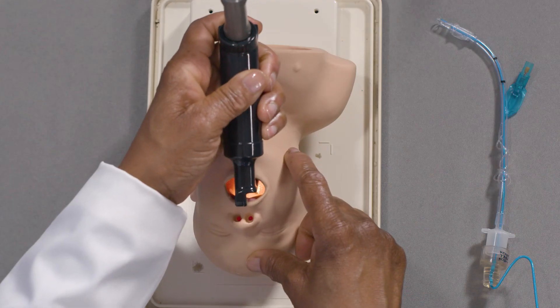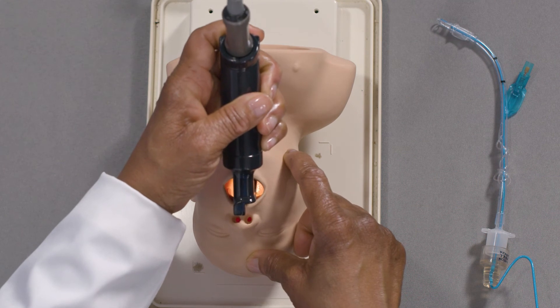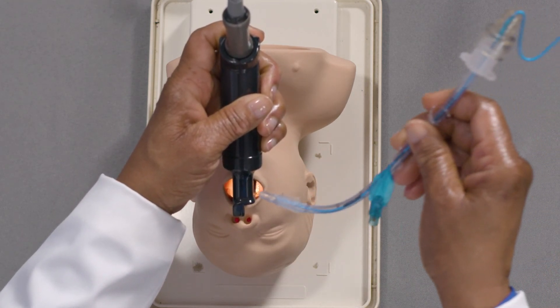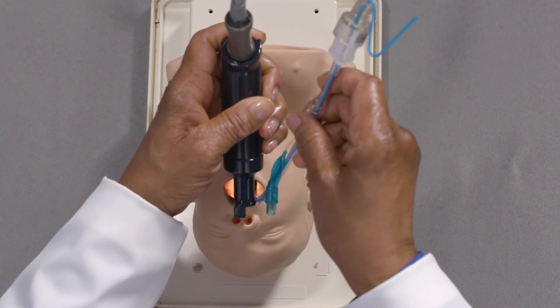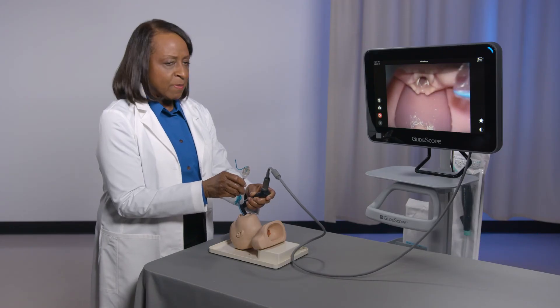In step three of the procedure, return your eyes to the patient's mouth. You will be inserting the endotracheal tube into the mouth. Introduce the endotracheal tube, and then as the tip of the endotracheal tube passes the base of the tongue, look back at the video monitor.